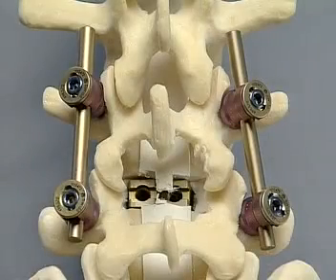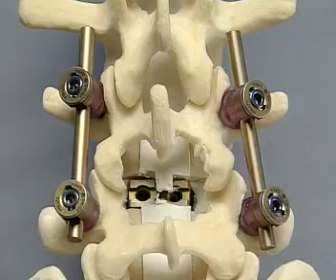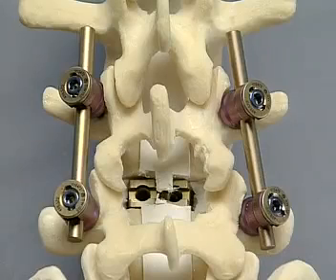In this exercise, an L4-L5 interbody fusion will be undertaken with contact fusion cages. As with other cages, contact fusion cages are not stand-alone implants, so they require additional posterior instrumentation. That can be either translaminar screws across the facet joints, or alternatively, a pedicle screw system.